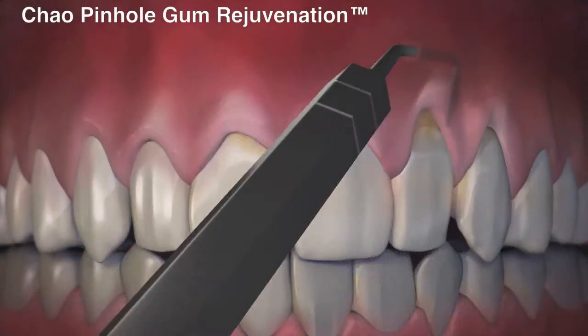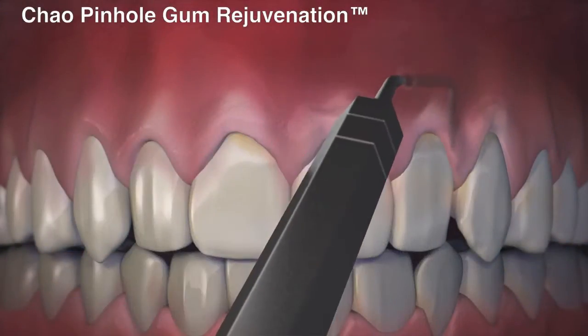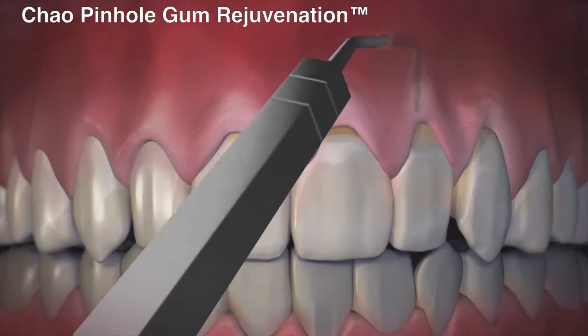Now, for the first time, really, in the history of man, we can manage recession with minimal pain and no sutures. So this is a breakthrough from old grafting techniques to new procedures. I'm excited that we can do this for people. And what could be better than that?